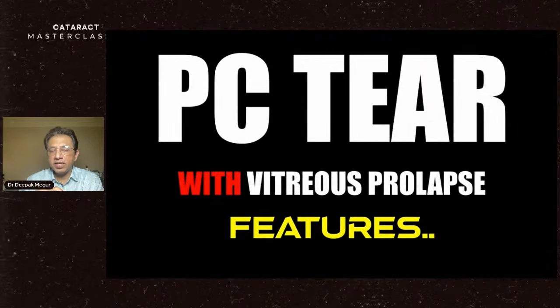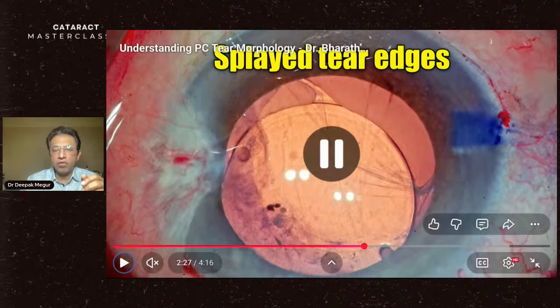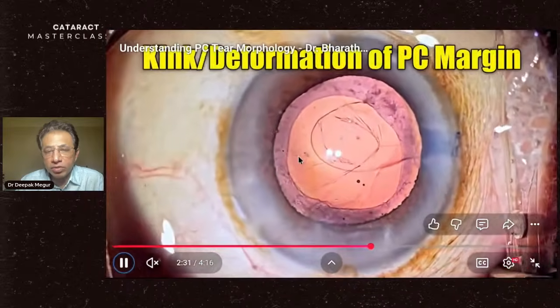Now, how does a PC tear with vitreous prolapse look? These are some of the common features. The edges of the tear would be very wide. Look at this: it's an extremely big posterior capsular tear. The edges are widely splayed. And here is another case of a wide posterior capsular tear.